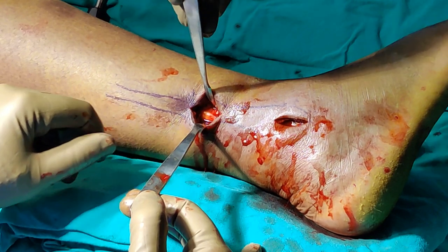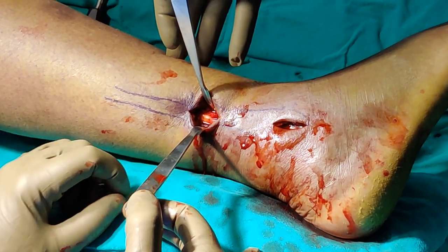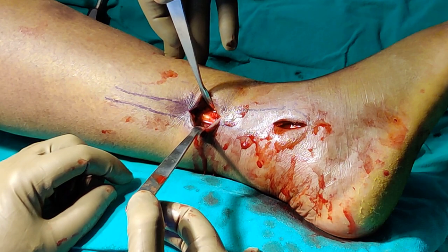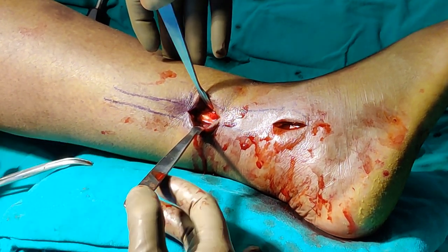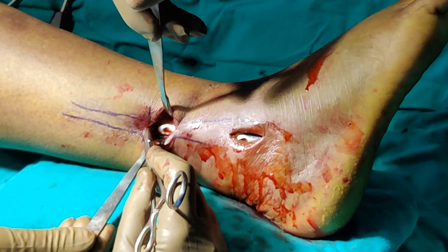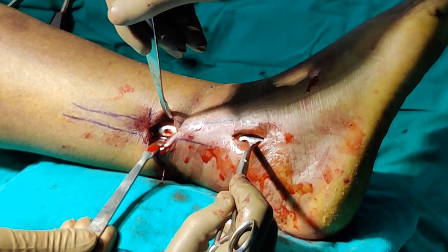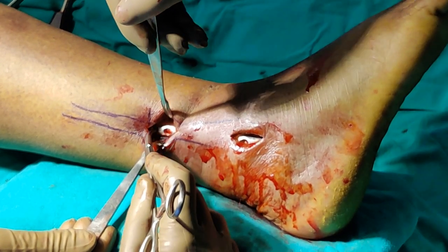The fibula proximally is now exposed; however, the plate was not seen, which means it had gone posterior. I readjusted the plate and after readjustment the plate is now dead lateral both distally and proximally. I am going to put a few screws distally first and then the proximal screw.